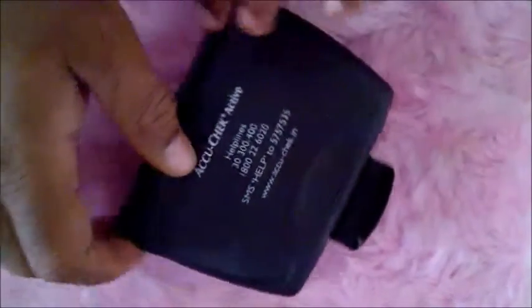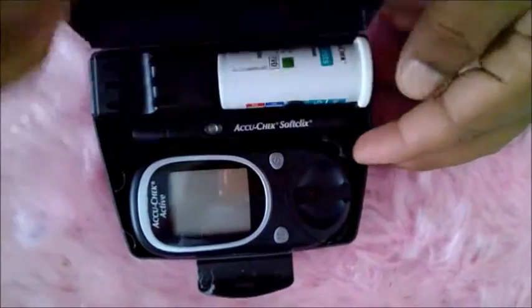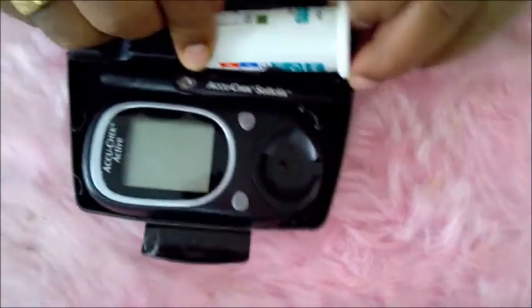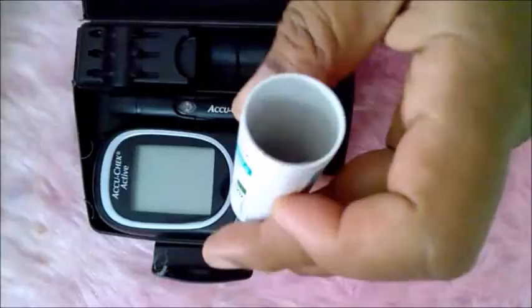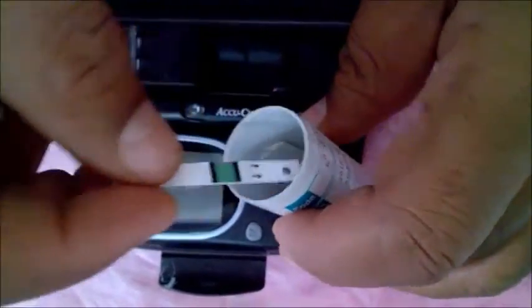How to check your sugar with the AccuCheck Active machine. This is the box — inside the box you see this small box for strips that you will be using to check your sugar. It looks like this: two arrows, and this side will be on the front side.